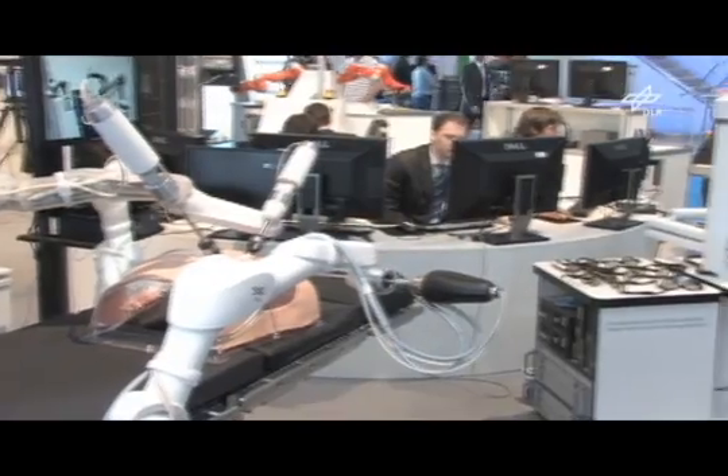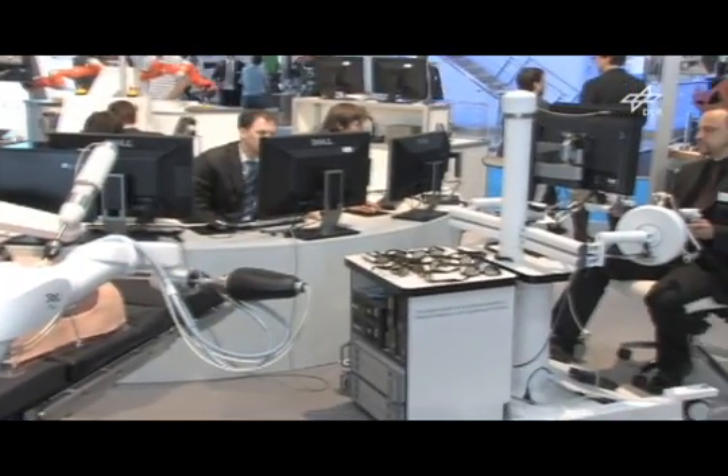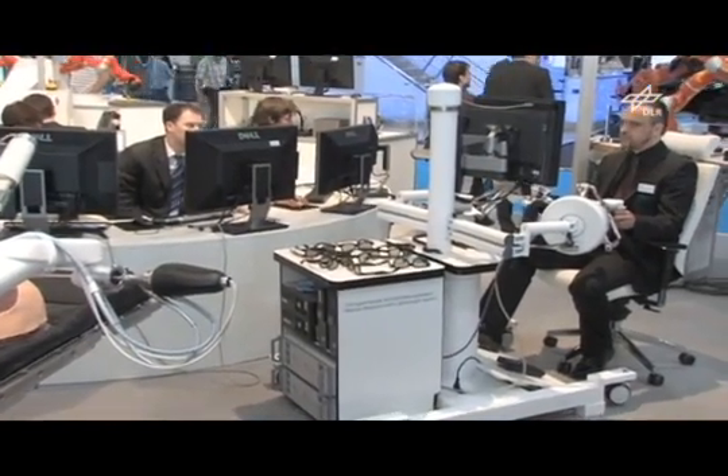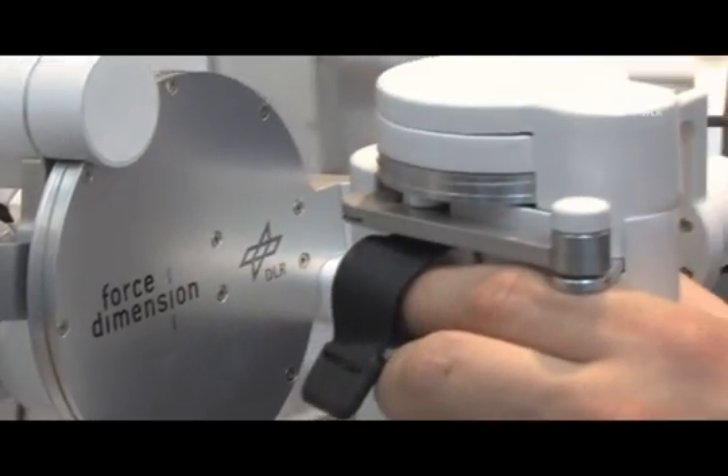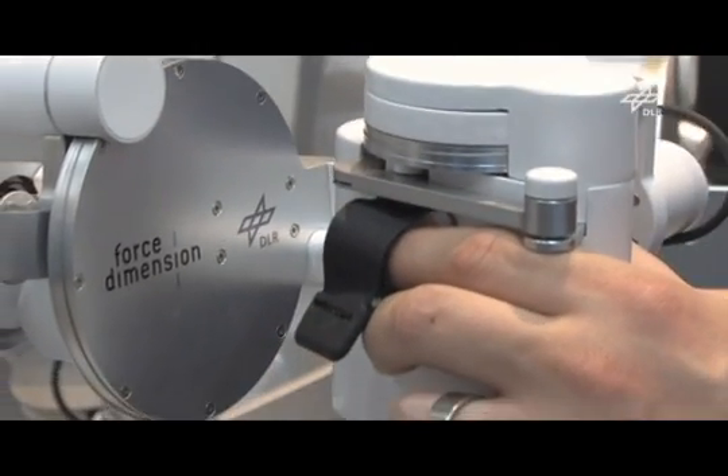The system is controlled remotely by the surgeon, who will be sitting at this command console. From there, the surgeon teleoperates the system with haptic input devices. Forces which are exerted on the organs are simultaneously measured and provided back to the surgeon.